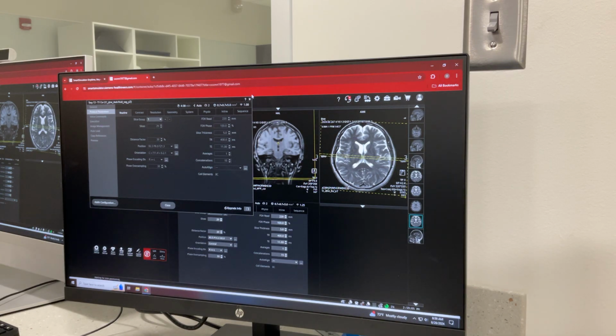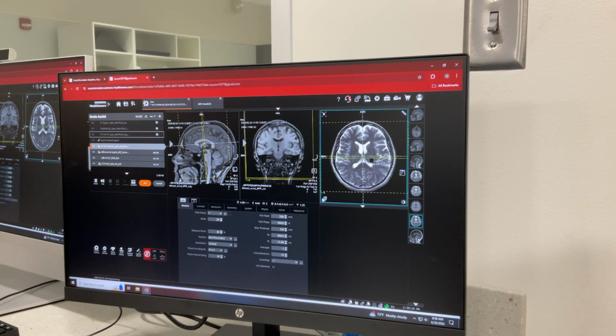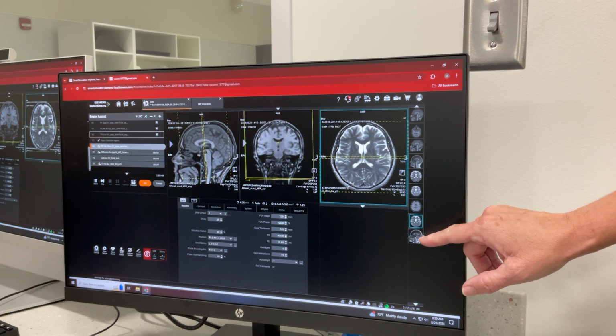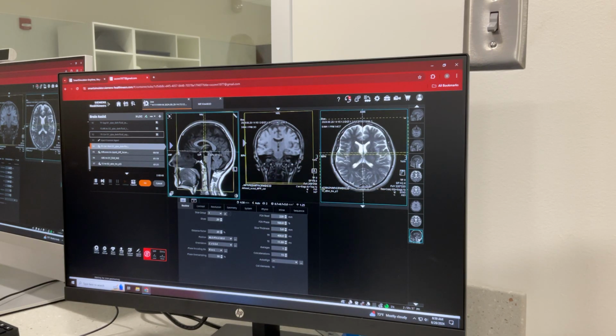So when we're looking at this axial reference image, we're gonna straighten out our slices so they're perpendicular to the longitudinal fissure. This one is so touchy. If you lost your good sagittal, pull that back over. Then we want our slices on that sagittal reference image to be perpendicular to the corpus callosum. And we're covering from that frontal sinus all the way through the posterior brain.